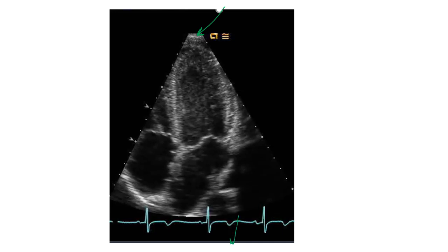So just below the probe in the apical 4-chamber view is the left ventricle. Posteriorly is the left atrium, and then the right atrium, and the RV. And this is the mitral valve, and this is the tricuspid valve. So this is the classical 4-chamber view of the heart.